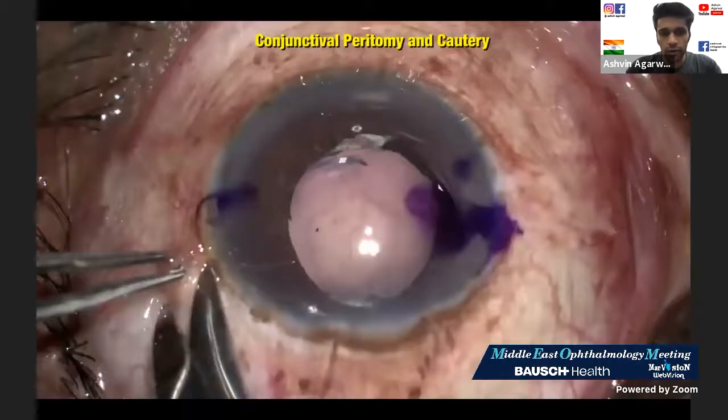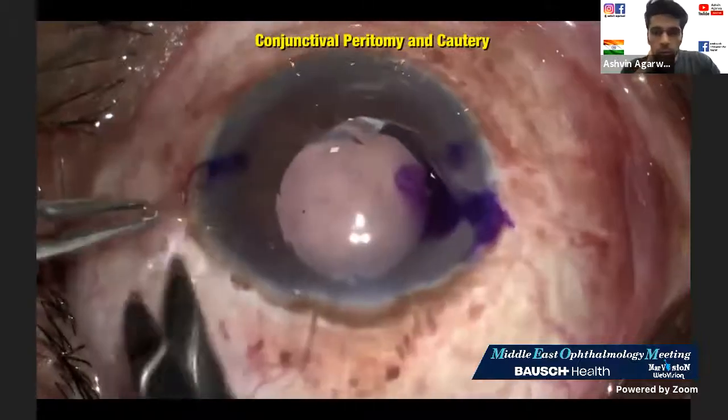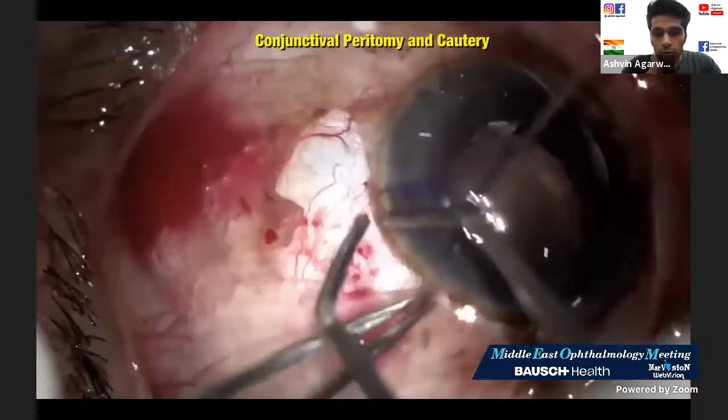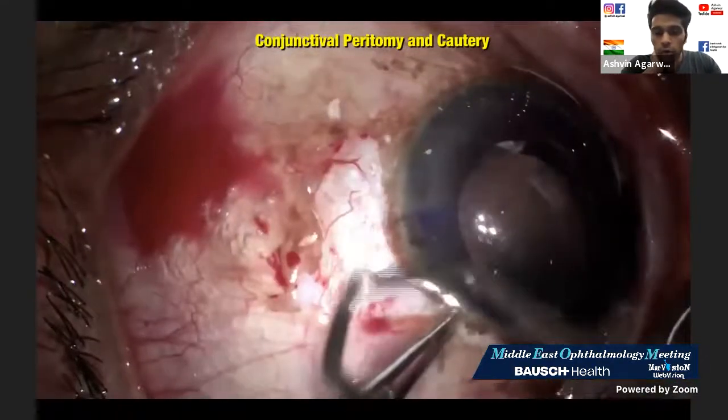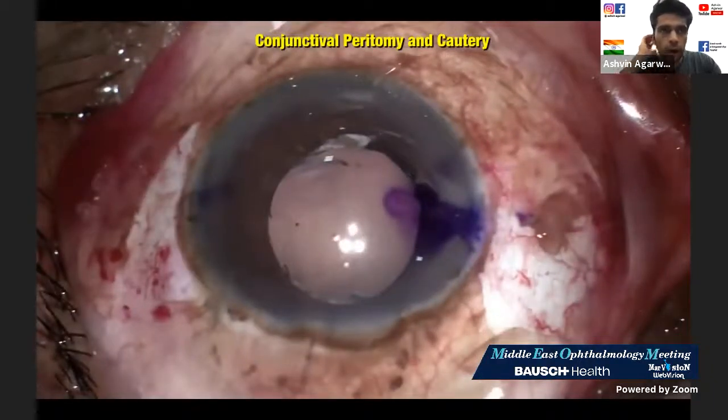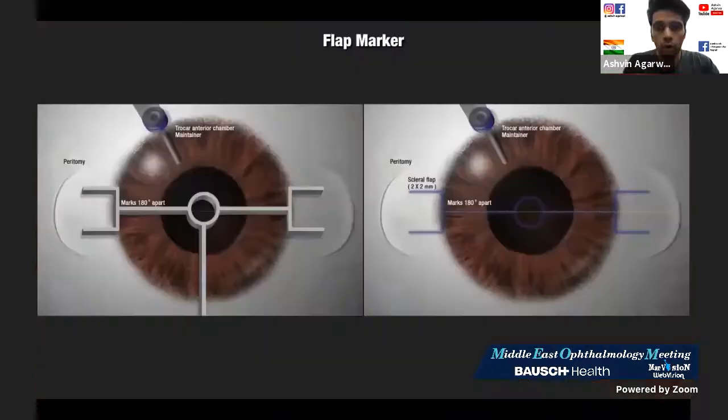Surgical procedure, let's dig straight into it. First up, we really need to make a conjunctival peritomy and cautery at 3 and 9 o'clock position. This depends basically on one major fact, the horizontal white to white. If the horizontal white to white is anywhere below 12 millimeters, I will make it at 3 and 9 o'clock. If it's above 12 millimeters, I will go vertical, because the vertical white to white is always going to be a little smaller than the horizontal.